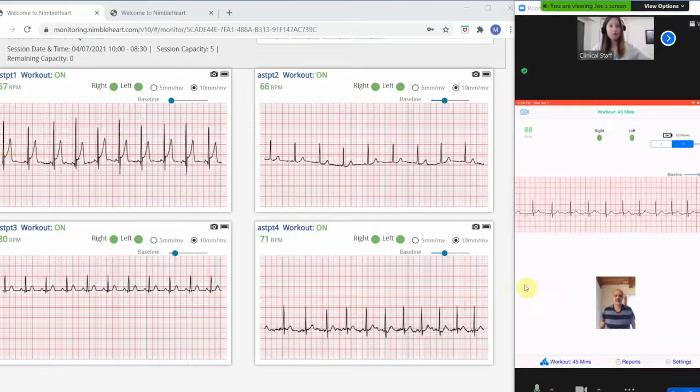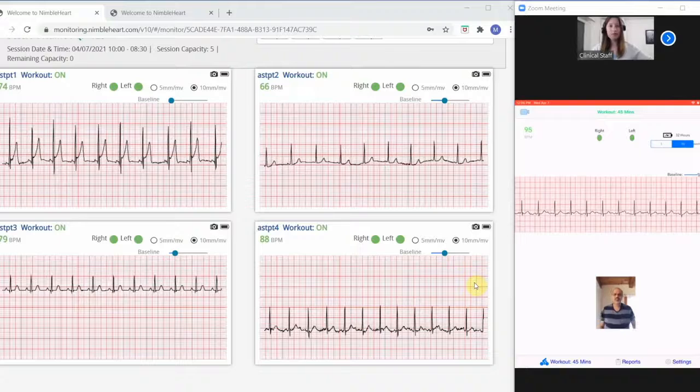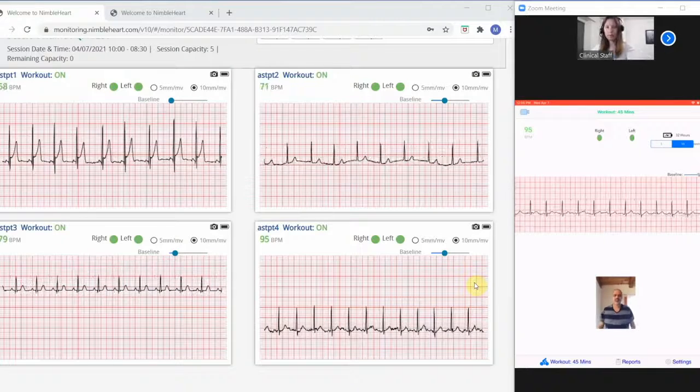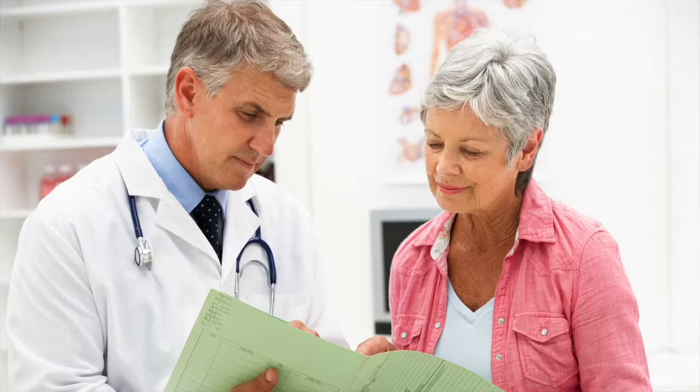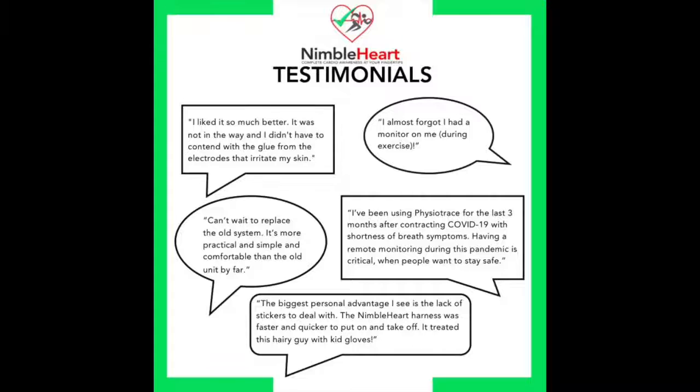Due to its convenient form factor and, most importantly, COVID-safe usability, patients can take home Physiotrace Smart during their hospital discharge with a cardiologist's prescription. At that time, they can be trained to use the monitor and do some or all of the rehab sessions from home as part of a hybrid or home-based rehab program. Taking the monitor home during discharge can give your patients peace of mind and also ensure their engagement and adherence during cardiac rehab.